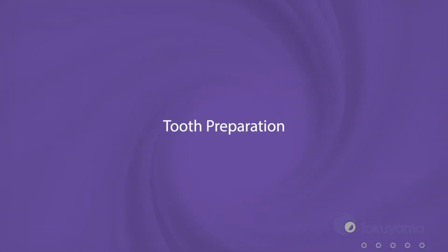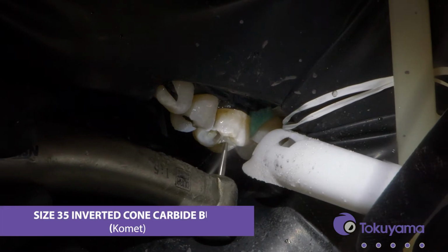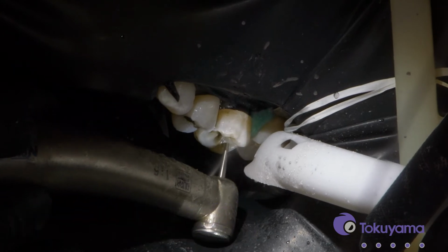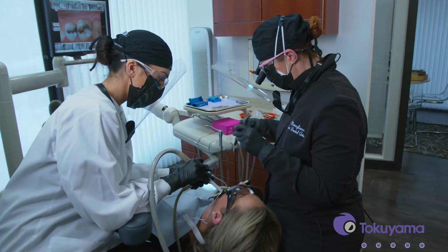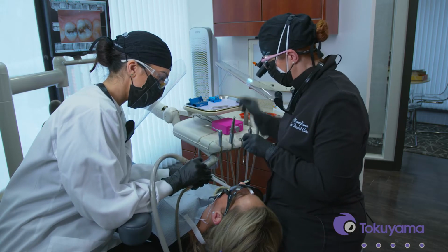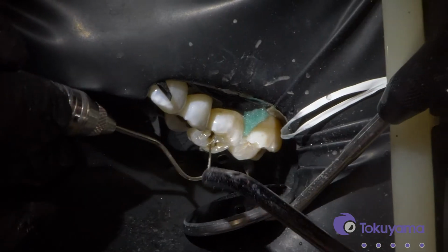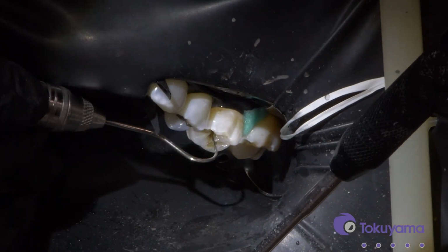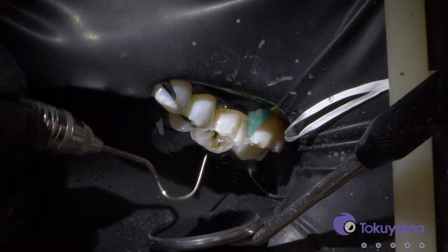For this preparation, I'm using a size 35 inverted cone carbide. I don't need mechanical retention for this restoration, but it removes amalgam very efficiently and it works comfortably in my hands. So that's my kind of operative dentistry burr. That's my go-to. A little bit more to remove.